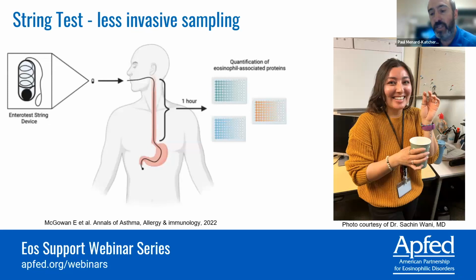So for less invasive sampling, one of the options that we have available is the esophageal string test. Essentially the details of the string test are presented on the left. There's a weighted capsule with a string put inside the capsule. You hold on to the end of the string and then swallow the capsule, which then dissolves, and then the string traverses the length of the esophagus. The weighted ball at the end of the string allows it to get all the way into the stomach and even the small intestine if that assessment is desired. The string dwells in the esophagus for an hour, at which point it is removed. The esophageal portion of the string is cut and then placed in tubes, and then a laboratory runs an analysis to quantify, in this case, proteins that are associated with eosinophils.